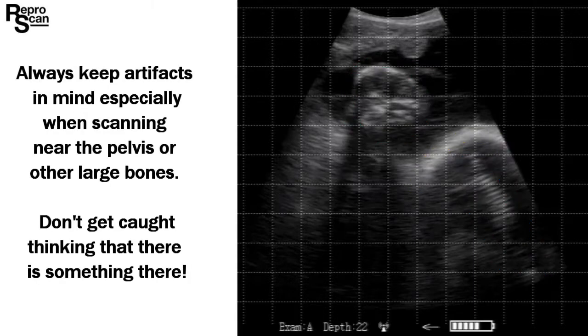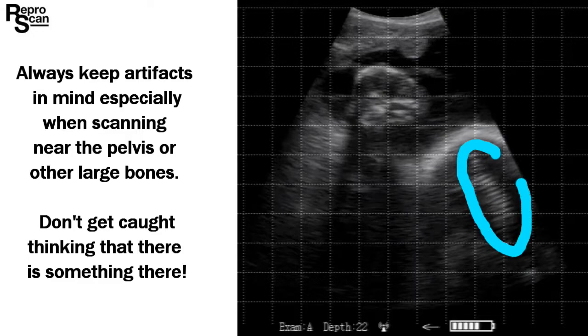Always keep artifacts in mind, especially when scanning near the pelvis or other large bones. Don't get caught into thinking that there's something there when there isn't.